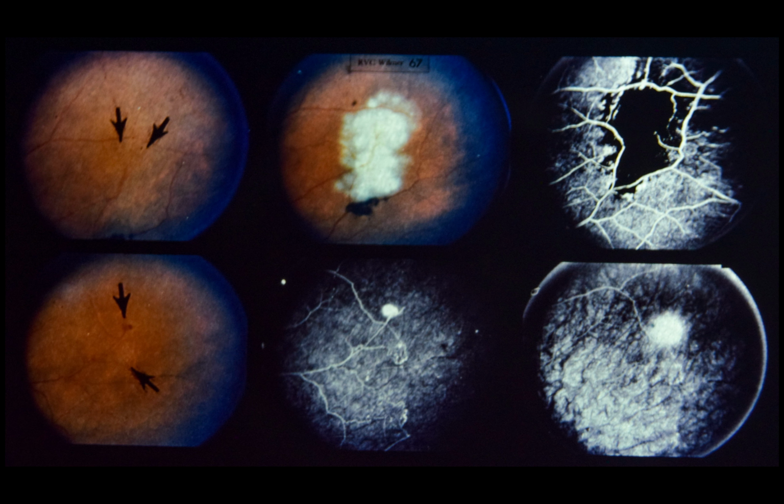3 months after photocoagulation treatment of the right eye, attention was directed to a small patch of surface neovascularization in the temporal periphery of the left eye, lower left. Note absence of retinal vessels peripheral to this neovascular frond. Capillary closure is appreciated better on the fluorescein angiogram, lower center. 15 minutes after dye injection, lower right, note marked leakage from neovascularization. This small neovascular frond was treated with argon laser photocoagulation as seen in the next slide.